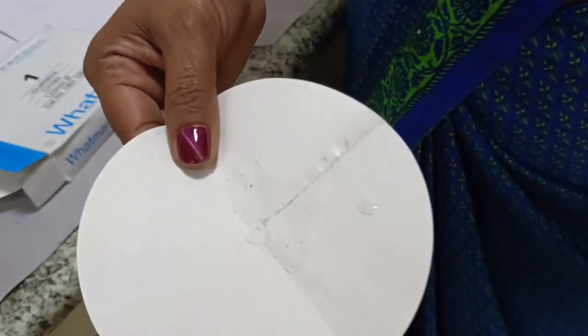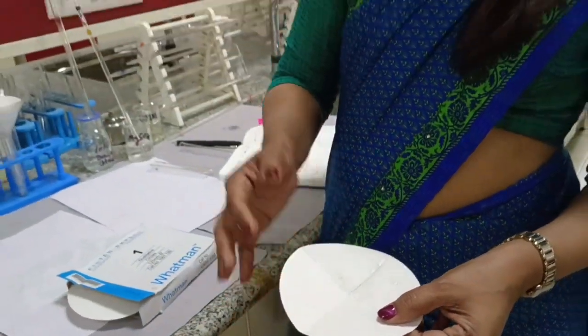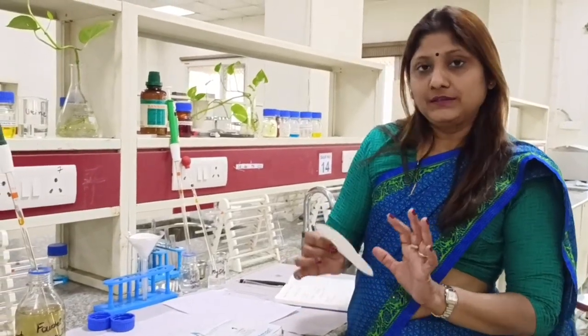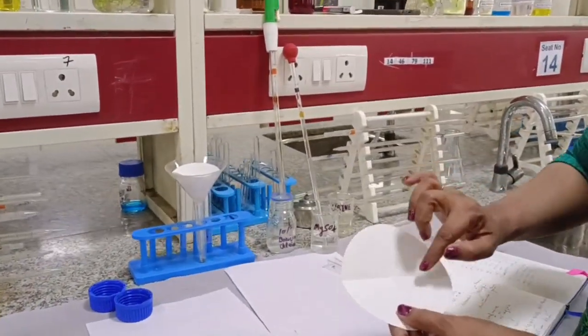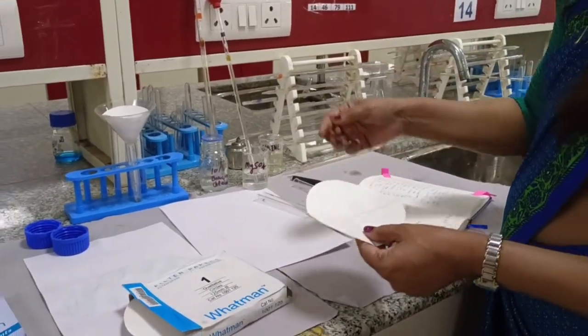If bilirubin is present in the urine, it will be adsorbed onto the barium sulfate precipitate on the filter paper. Though we cannot visibly see the bilirubin, it is adsorbed onto the barium sulfate. Now we have to dry this filter paper in a hot air oven at 50°C for 5 minutes. After drying, you can see the barium sulfate precipitate on the paper, and the bilirubin, if present, is adsorbed onto it.